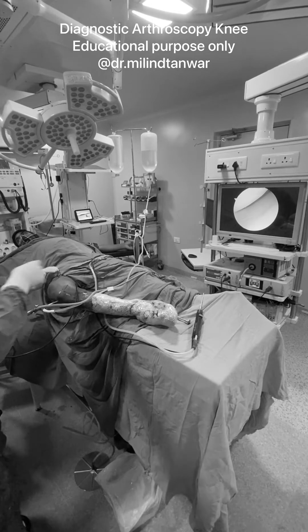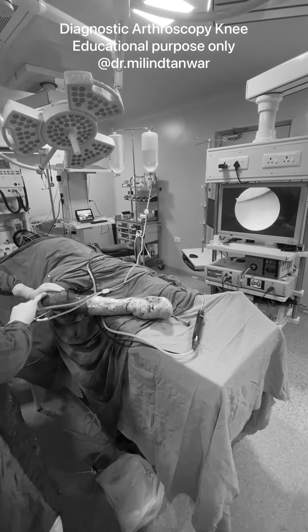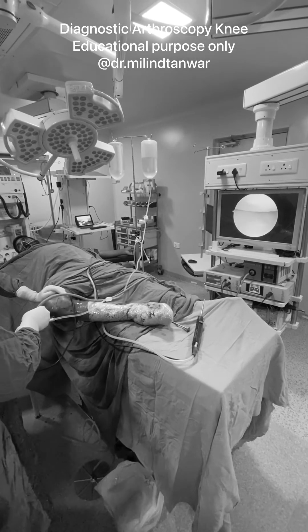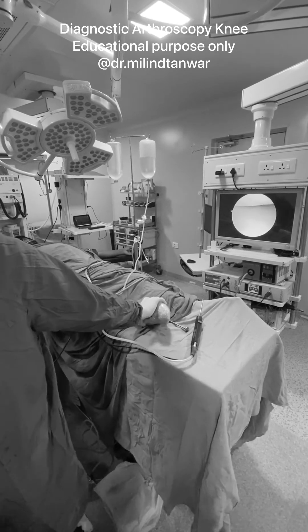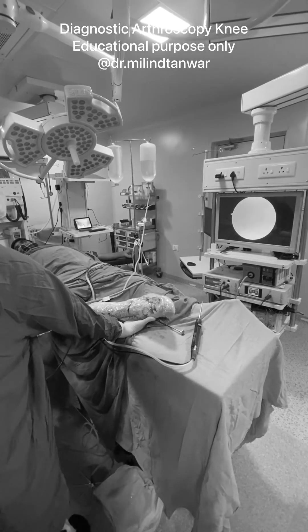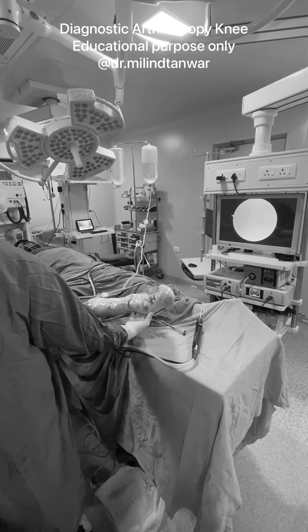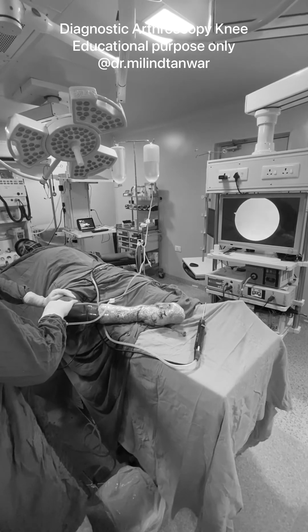Your assistant will try to push the femur down and you can open up the lateral space. Once you rotate the camera, you can see a horizontal meniscus — that is what you want to visualize. If you want more visualization, you can lift the leg up with one hand and locate it with the camera. You can see the undersurface, oversurface, and all areas of the lateral meniscus. Once you reach the anterior horn of the body, leave the foot down and then examine.